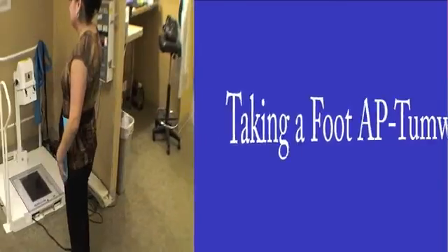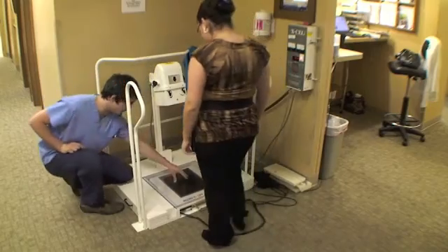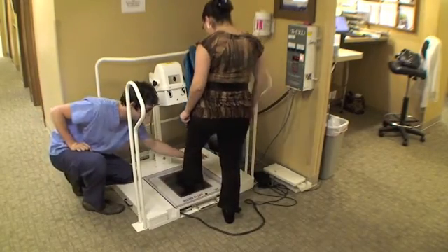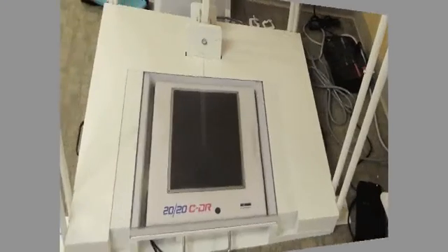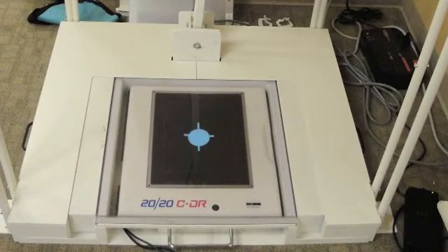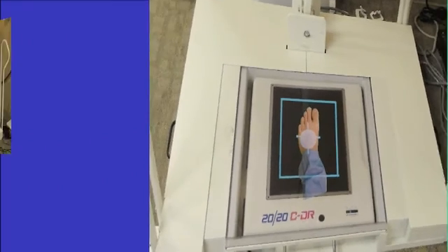We'll now discuss quickly how to set up the platform and X-ray head to meet the angle requirements for each shot. To take an AP foot, you will have the patient stand on the platform while the cassette is under their foot. Make sure only the foot of interest is in the blackened area. Within the blackened area of the cassette, you will see a light blue bullseye as well as guidelines around the edges. You will want the patient to position their foot so that they are directly within the guides and their foot is centered on the bullseye.